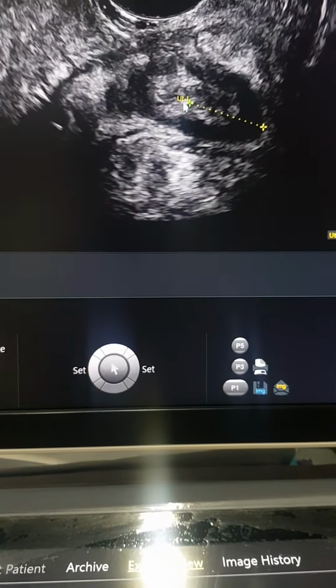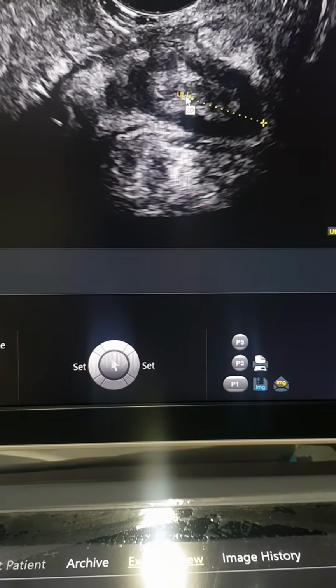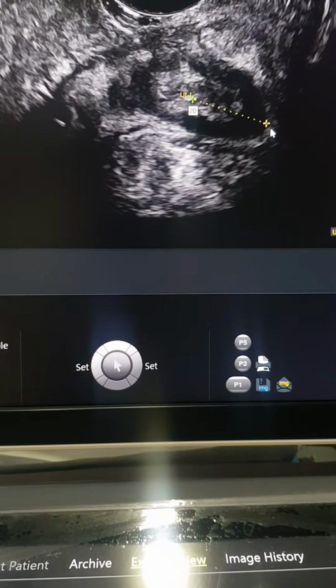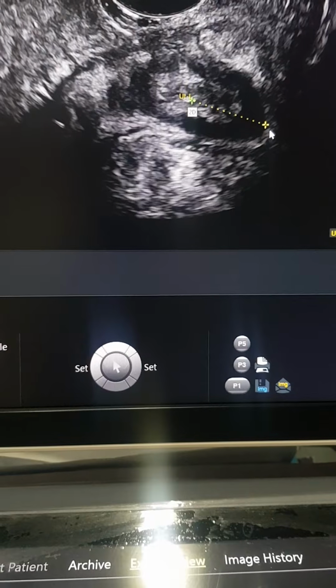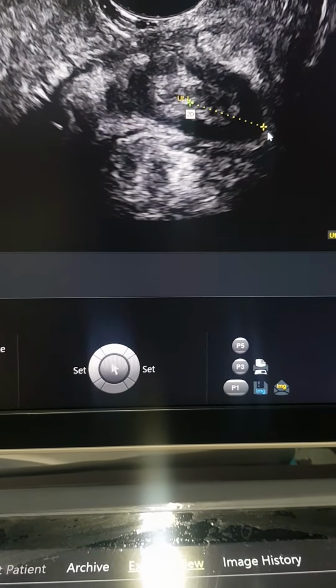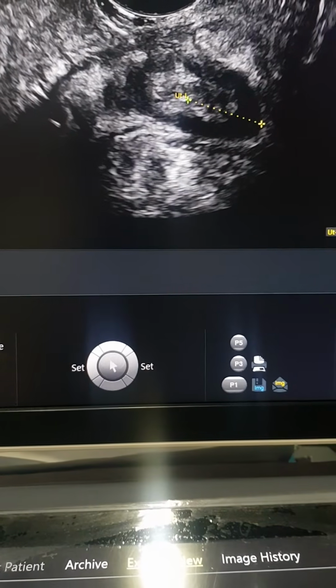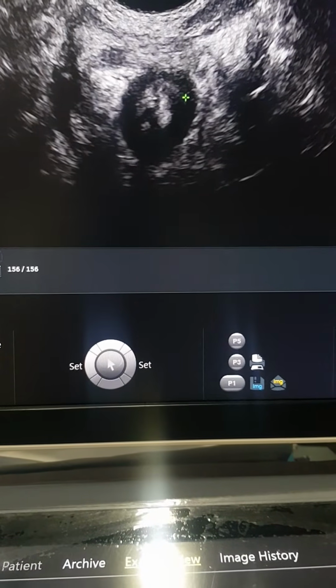Then I took the sagittal view of the anal canal and realized that the thread was opening at this part of the anal canal, and we measured the distance from the internal opening to the anal verge, which was 15 mm. So that was the level of opening of the fistula internally from the anal verge. We got the height of the opening from the sagittal plane.